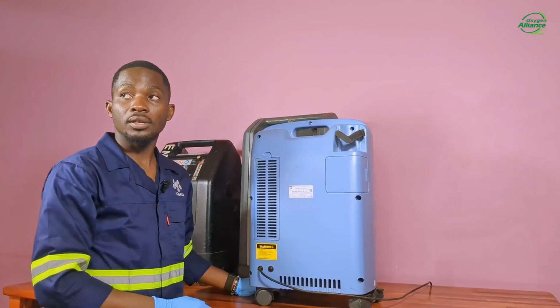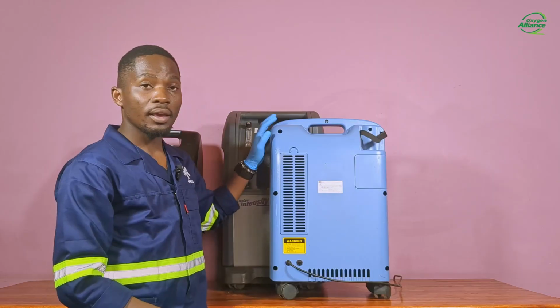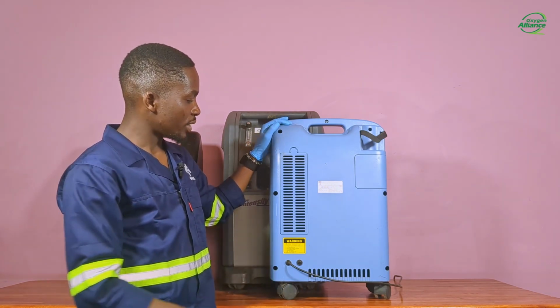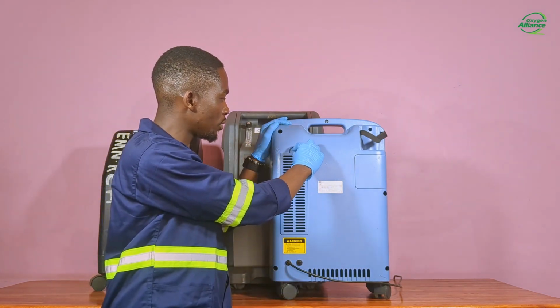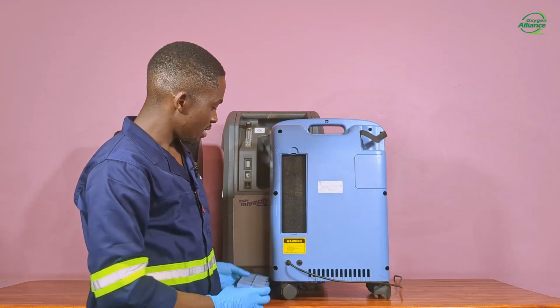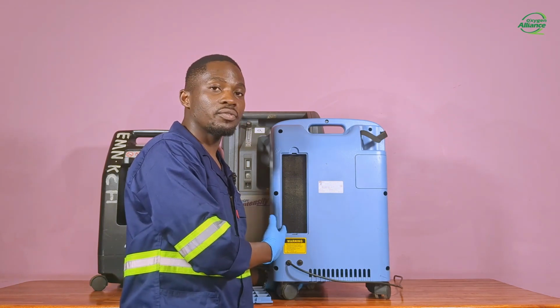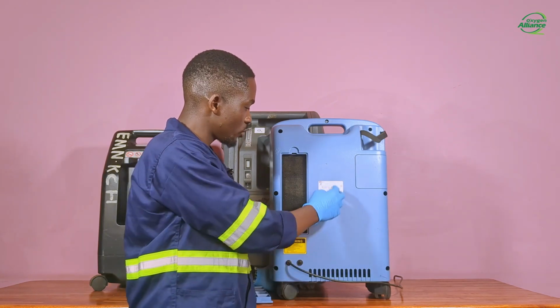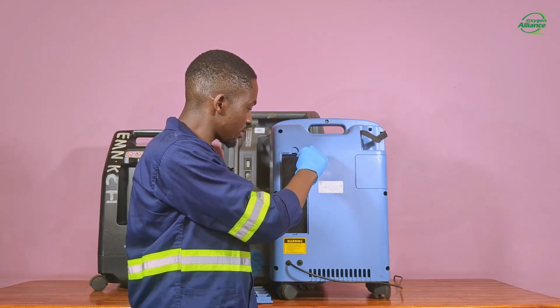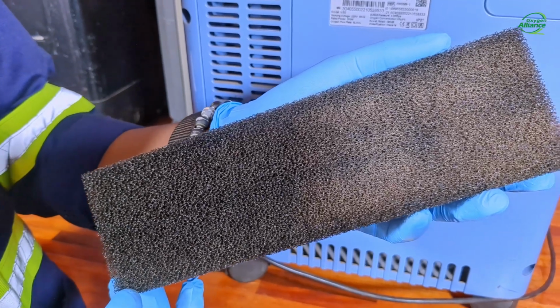In most models of oxygen concentrators, you find the air filter placed at the back of the machine, and to access it, you just pull the cover and here we have our intake filter. To remove it, you just pull it out from its place and then you can go and wash it.